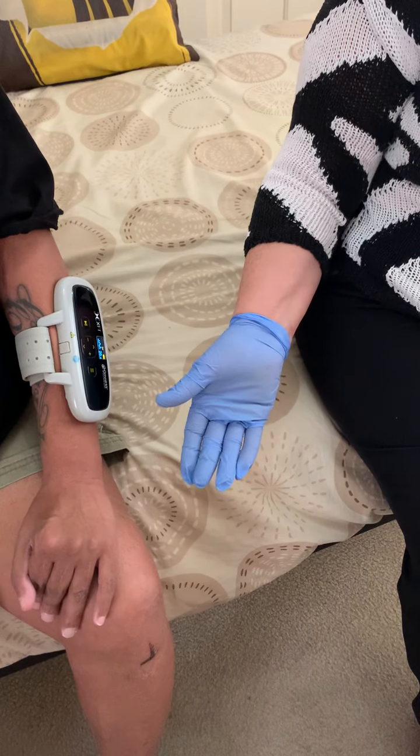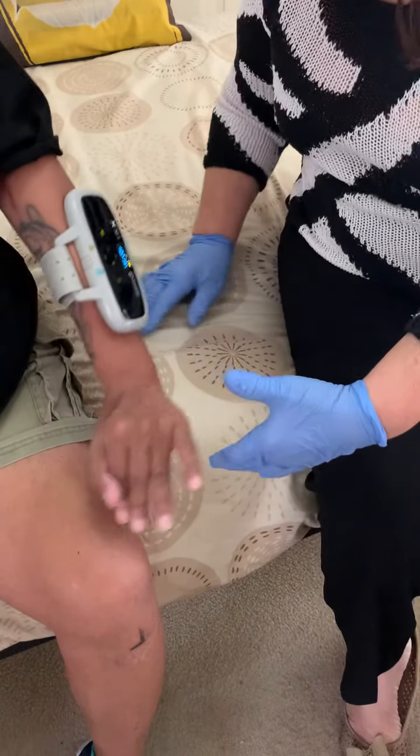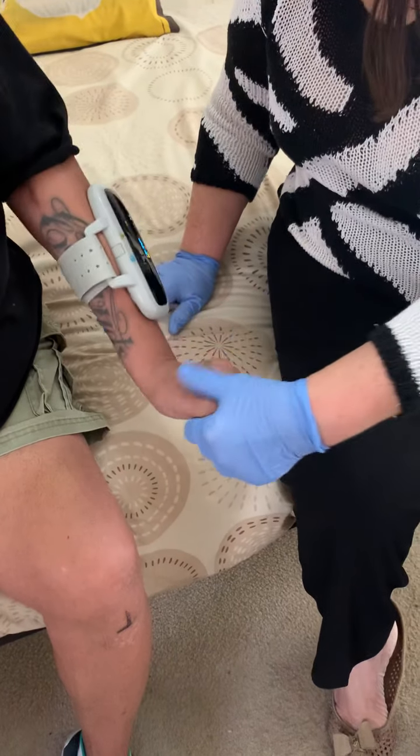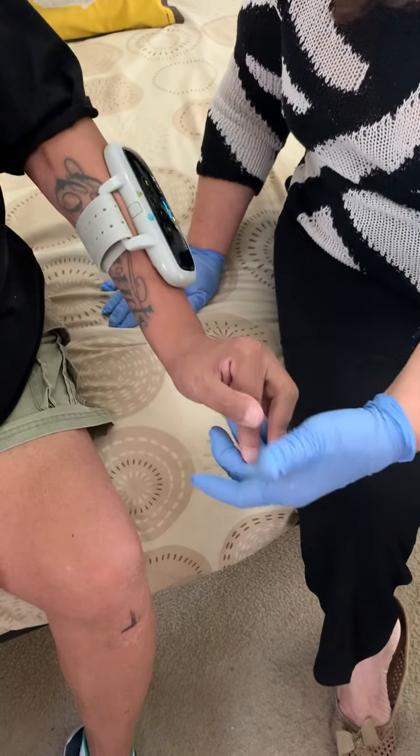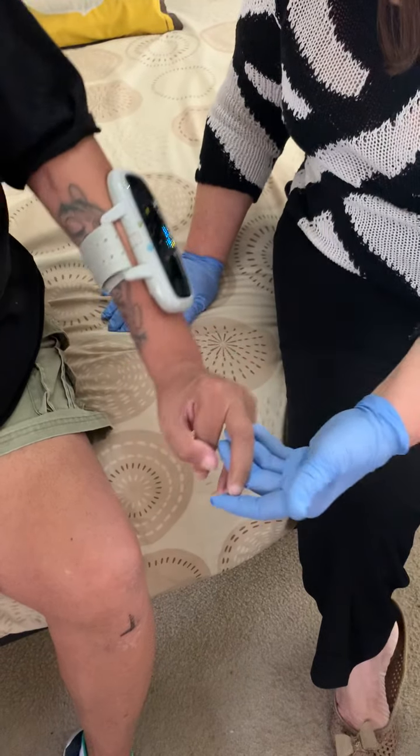which is really important to do. Now, I'm just going to wait a second and go one, two, three — shake hand. I'm not doing it. You're doing it. That's correct. I'm not moving. You're moving it.